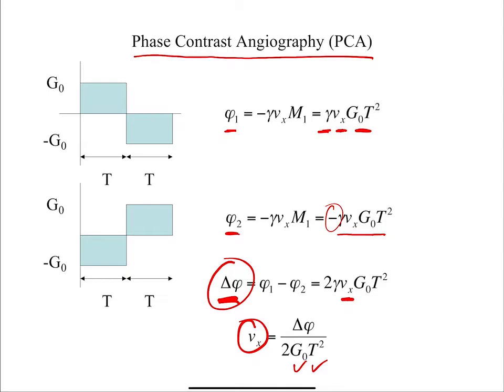All right? So, yes, question? How do those not equal 0? Just look at the diagram, shouldn't it cancel out? You mean the top and the bottom gradients? Yeah. Okay. So if you think about 0th order moment and 1st order moment, the way to think about 1st order moment is imagine these as weights. If you imagine a weight like this and a weight like that, and you think about pulling those two things, the 1st order moment is whether that's going to rotate or not. So this has a 1st order moment, and then this has an equal and opposite 1st order moment because it's going to rotate the other way.